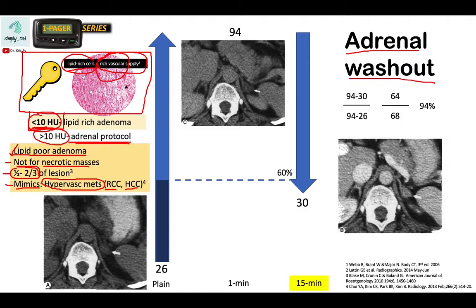Okay? So now let's move on to how we can remember the equation for the percentage washout. Okay, so let's look here first at the 3 measurements taken. We have the plain, we have the 1 minute, and the 15-minute scan.